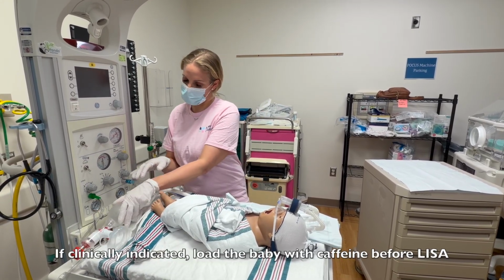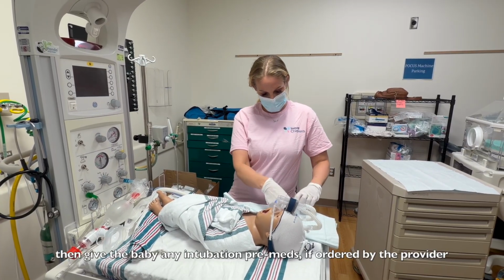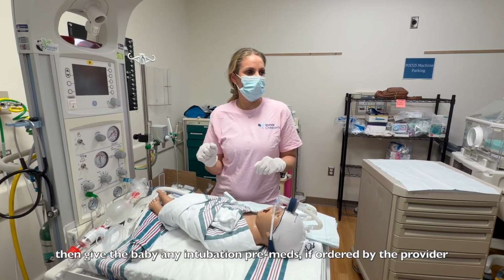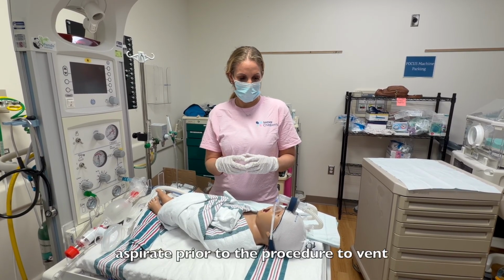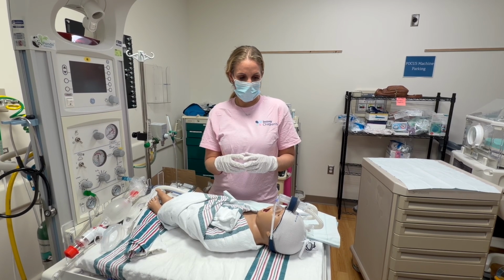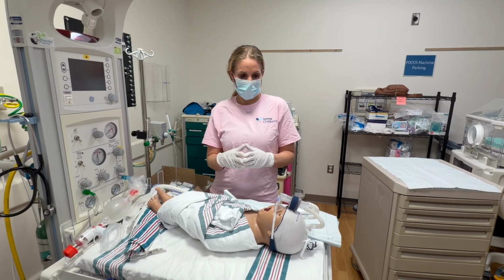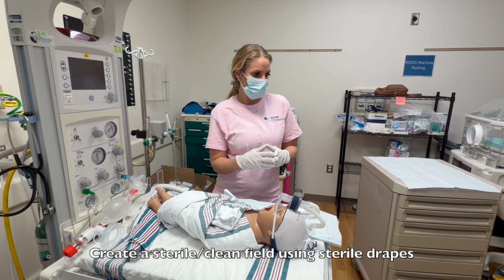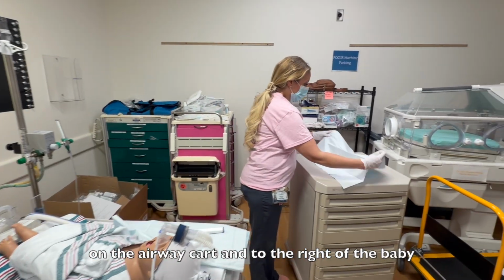If clinically indicated, load the baby with caffeine before LISA and give the baby any intubation pre-meds if ordered by the provider. If the baby has an OG tube already in place, aspirate prior to the procedure to vent. If the baby does not have an OG tube, you do not need to place one prior to LISA. Create a sterile/clean field using sterile drapes on the airway cart and to the right of the baby.